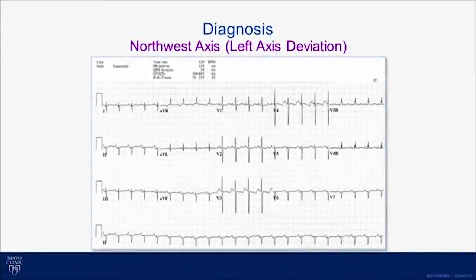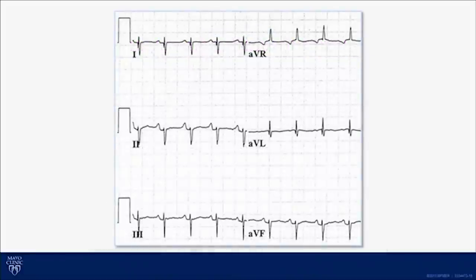We're going to look at an ECG and talk about how you determine the difference between left-axis deviation and right-axis deviation in a patient with an axis that falls in the northwest quadrant. If we take a look at a close-up of this ECG, what you can see is that in lead I and AVF, there's a negative or downward deflection.